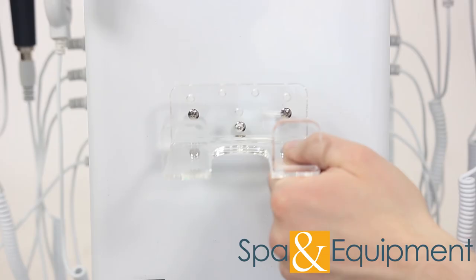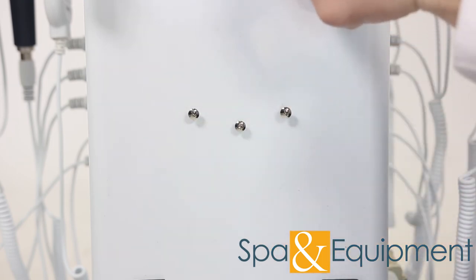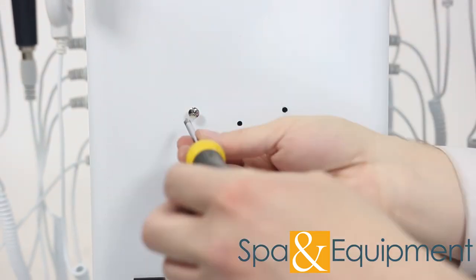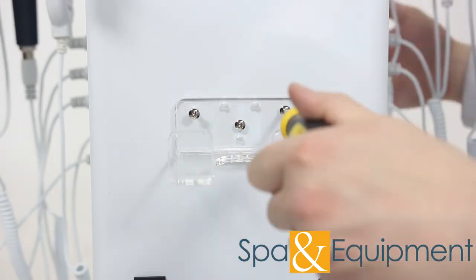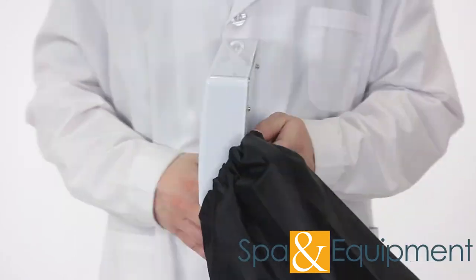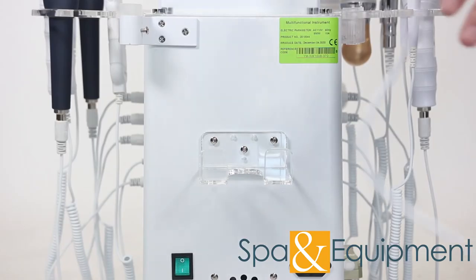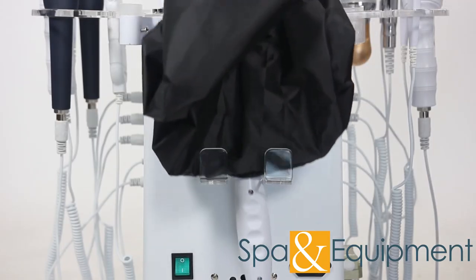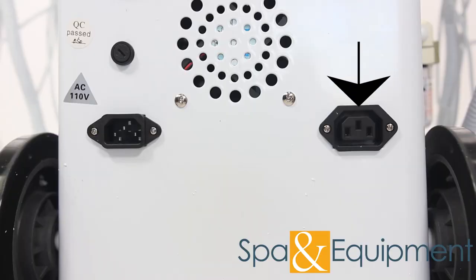On the back of the unit, the woods lamp holder needs to be installed. Go ahead and unscrew the three screws and install the holder like this. Next you can take the woods lamp and attach the hood, then it can go in its holder. The woods lamp plugs in here.